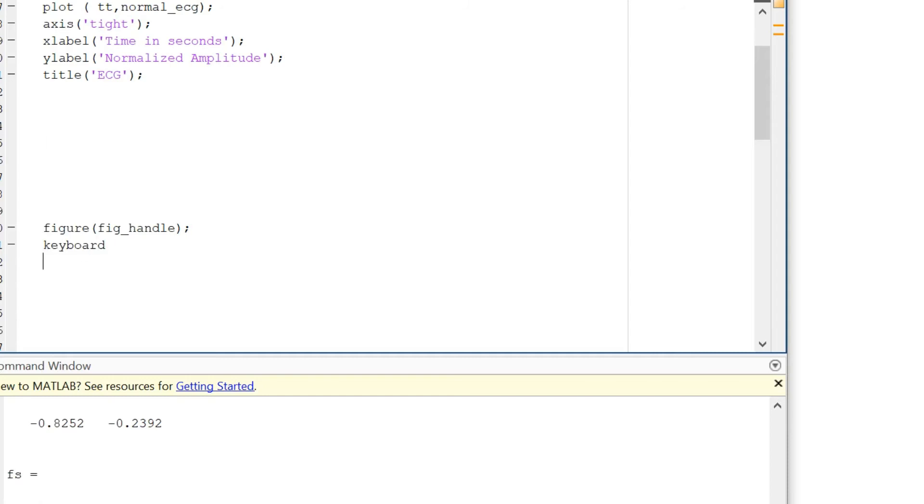Now this will pause your code until you give a command to MATLAB to continue. We are going to use this just so that we can maximize the ECG signal to the point where we can extract the ECG PQRST curve.